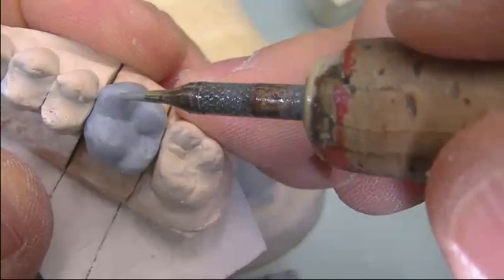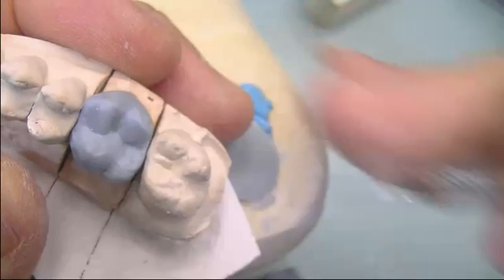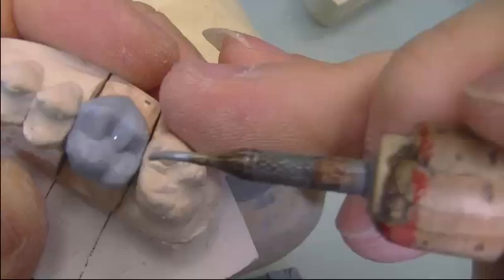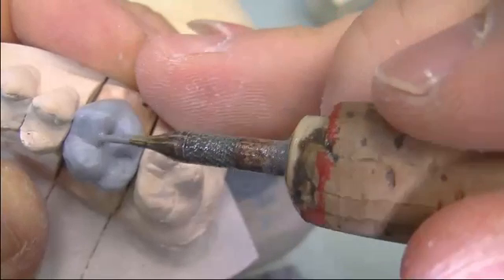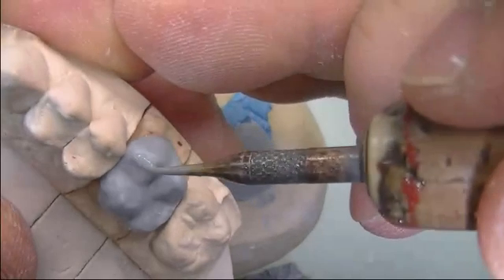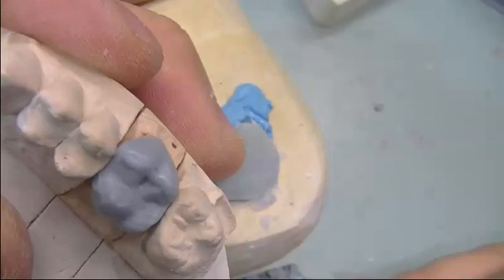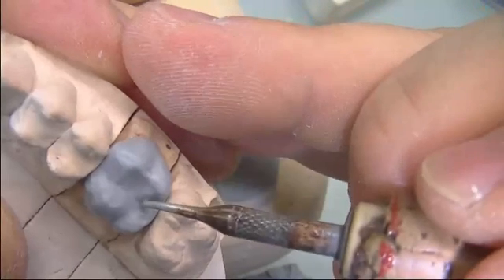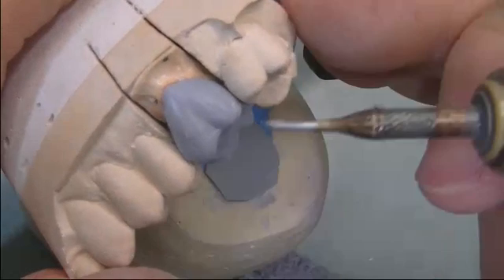We notice the buccal is out of occlusion, so we start adding the triangular ridge — the distal triangular ridge — to bring the occlusion in a little. That gets the lingual cusp tip into occlusion. Now we bring the buccal cusp into alignment. The buccal cusp tip is a bit short, so we add length to it, both on the mesial and the distal.